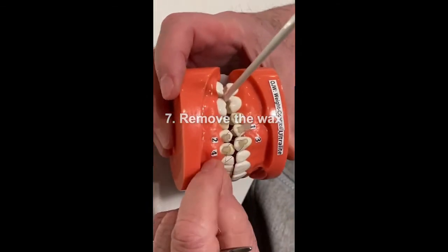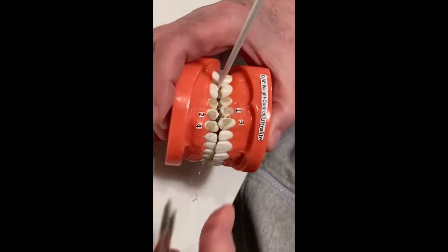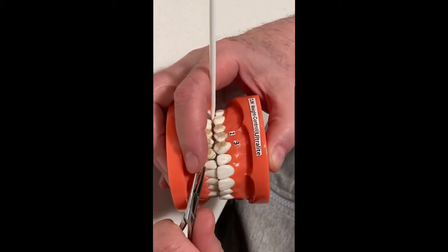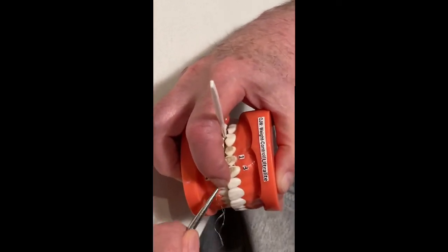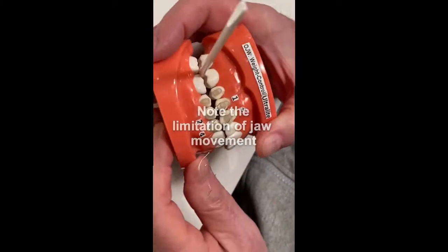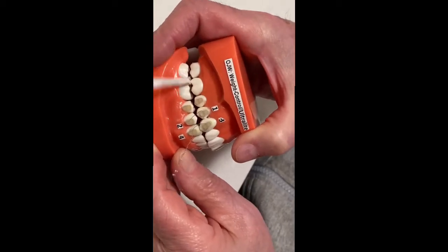You'll need to remove the little piece of wax, and then this is the way it looks. There's the amount of limitation of the envelope of motion of your jaw.